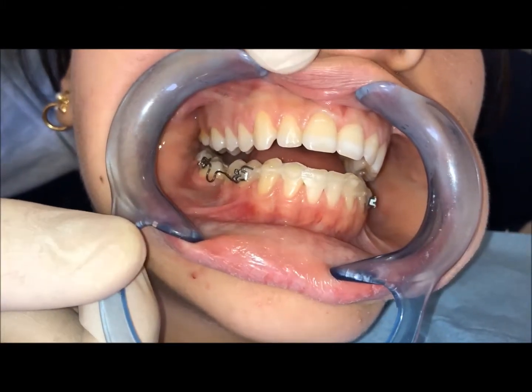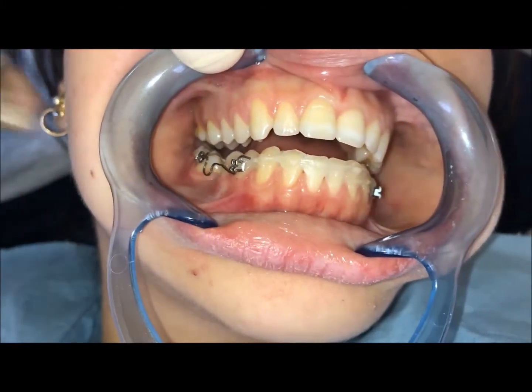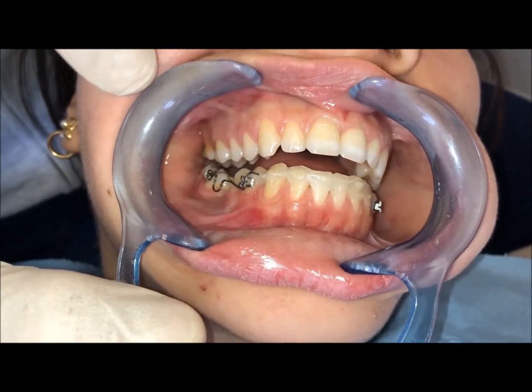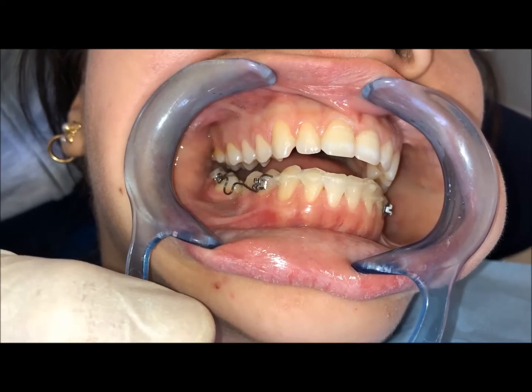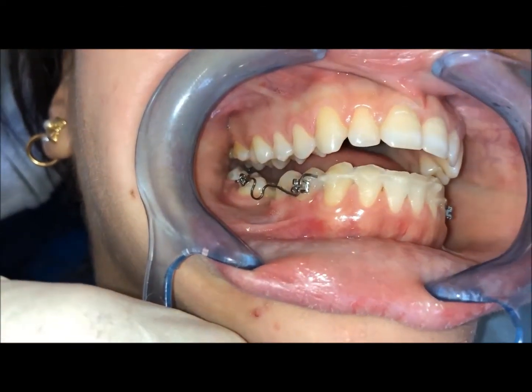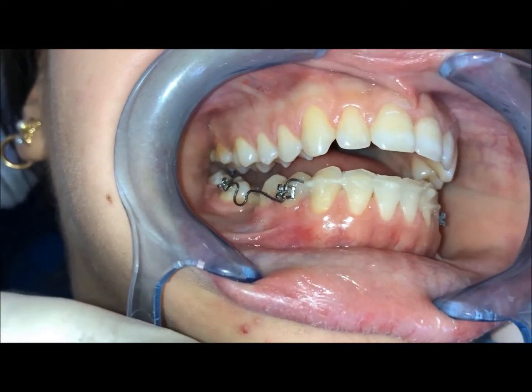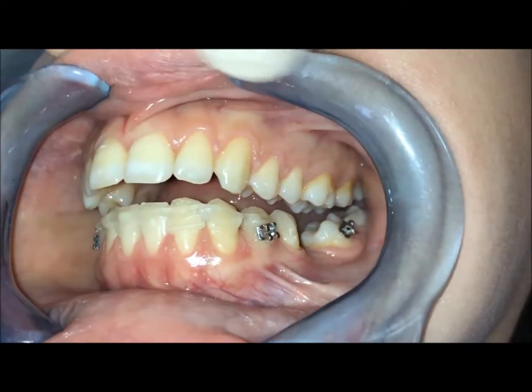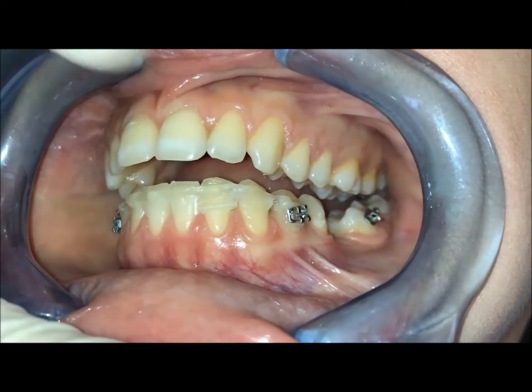Hello. In this case we have a canting of a second molar because this patient lost the first molar. So we have a tipping of the 47 and we have a tipping also of 37.